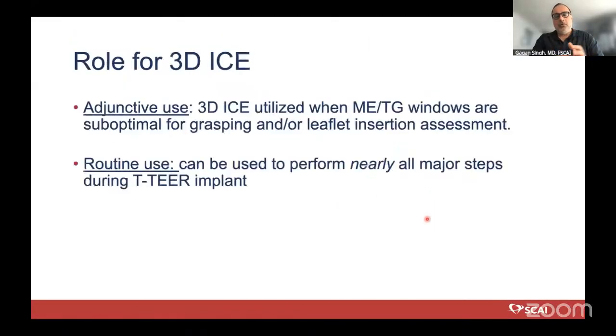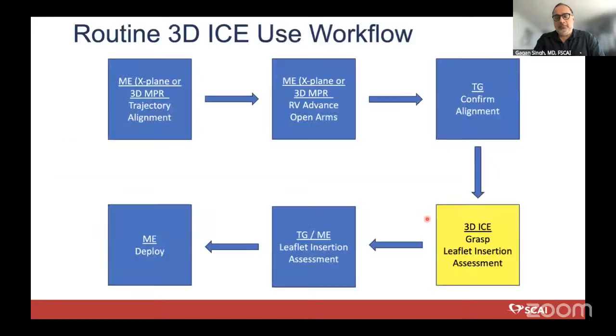And so the role for 3D ICE is really as follows. You can either use it routinely, and I'll show you what that workflow looks like, or use it as an adjunct, and probably adjunctive is not even the right word. It's maybe an as needed. And we'll talk about what that looks like. And so here's the workflow that I think some centers across the United States have adopted, which is if it's going to be part of your regular workflow, this is what happens.